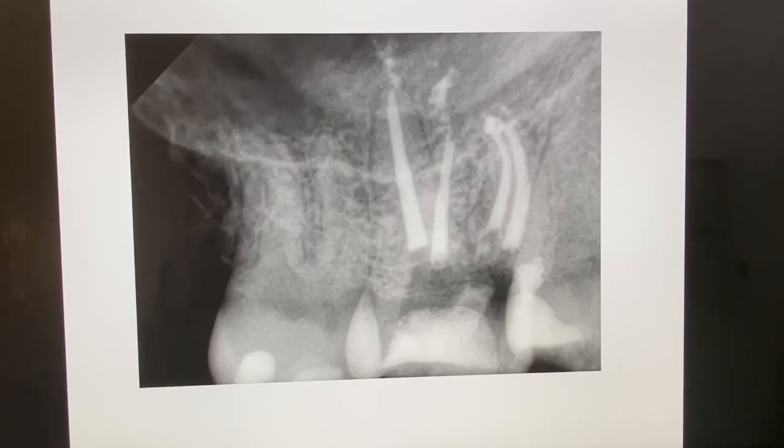The third one: if there is a lesion on a root and you are sure that you did excellent work and procedure in the root canal treatment, and the lesion persists, then mostly there is a missed canal, and you should search for another canal. Here the CBCT will help you very much in searching for such canals. Whenever the work is above your capability, just stop please and don't do further destruction.